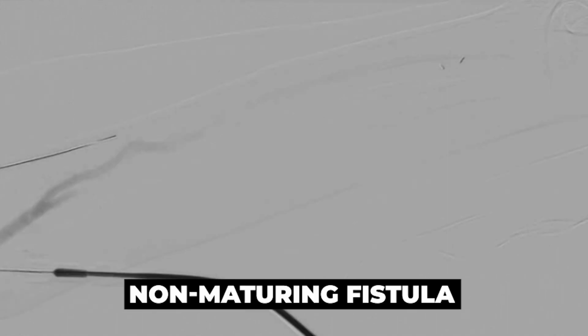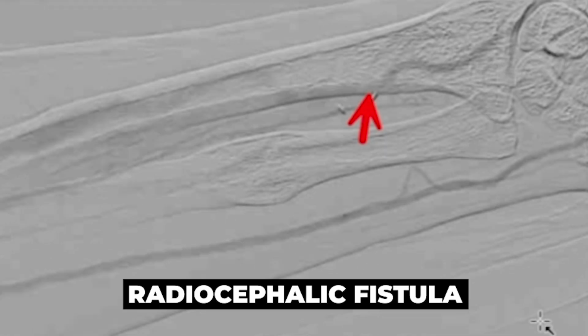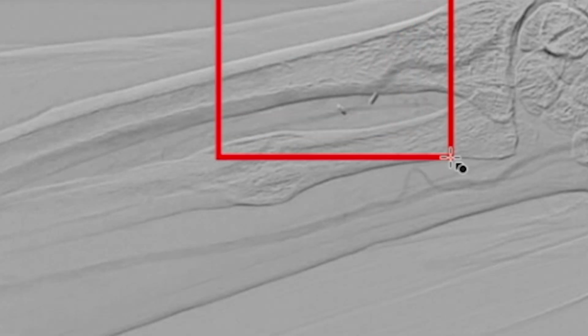This is a very difficult case that I had recently. It's a patient with a non-maturing fistula in the left upper extremity. As you can see, the arterial anastomosis was a surgical fistula, a radiocephalic fistula, but it's not maturing. The reason it's not maturing is because this part of the vein is very atretic.